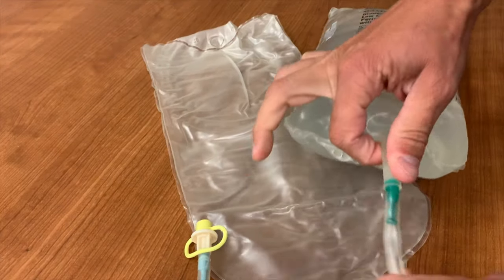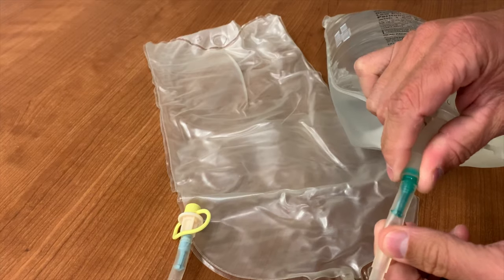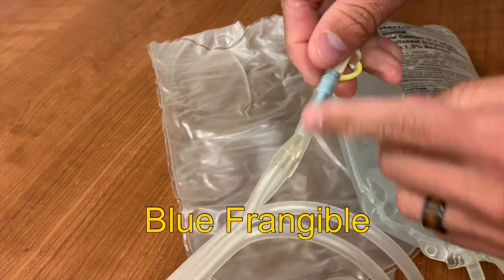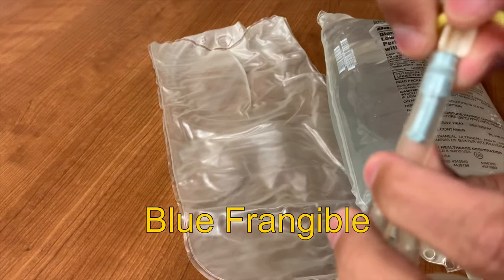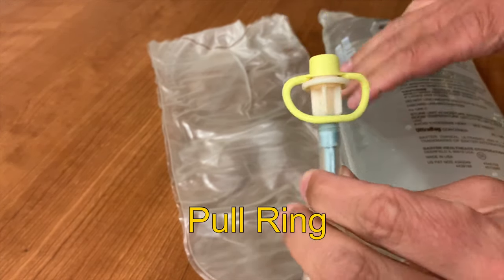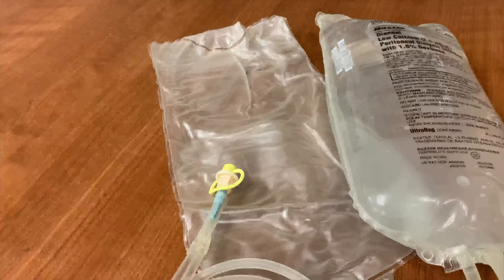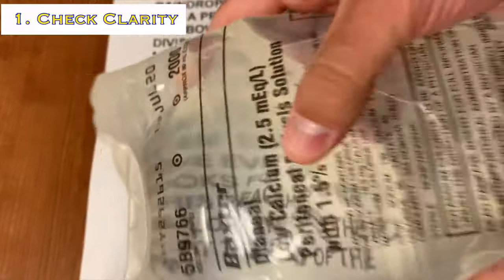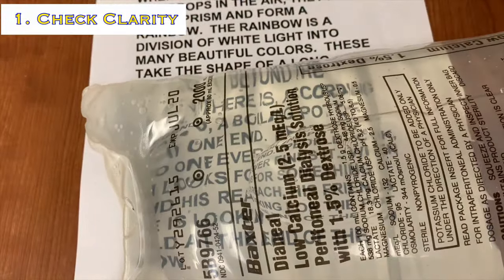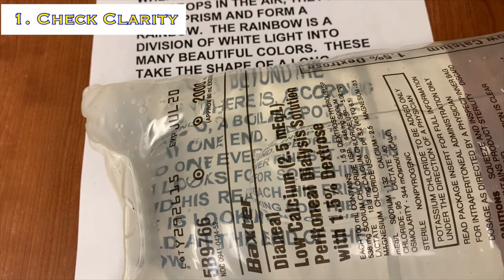Return to the dialysate bag and notice the green plug at the end of the bag — this is known as a frangible, and it should be in one piece. At the end of the tubing, there's another frangible; this one's blue, and it should also be in one piece. Above that frangible is a yellow pull ring. If either of the frangibles are broken, or the yellow pull ring is not in place, replace this bag with a new one prior to administering dialysis. Now inspect the fluid by placing the bag over top of any written word. If you can read the words through the fluid, it is clear. If you can't, it's considered cloudy, and the bag will need to be replaced.